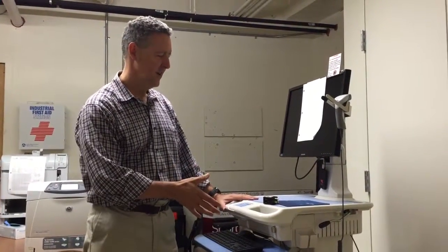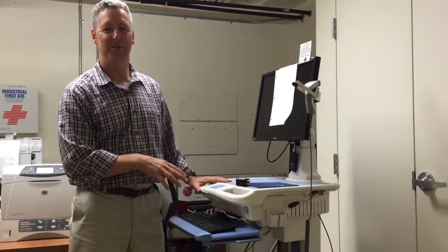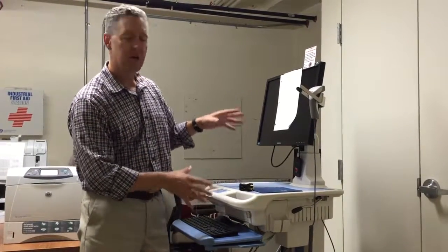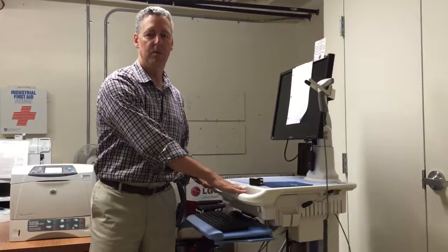Hi, I'm Steve Maher, the ergonomics guy, and this is a workstation on wheels. It used to be called a computer on wheels, but the acronym is COW, and patients didn't like that. So it's now called a WOW, or a workstation on wheels. It's a computer cart that allows you to move from room to room, and we're seeing this in a lot of healthcare situations where you can take this from one patient room to another.